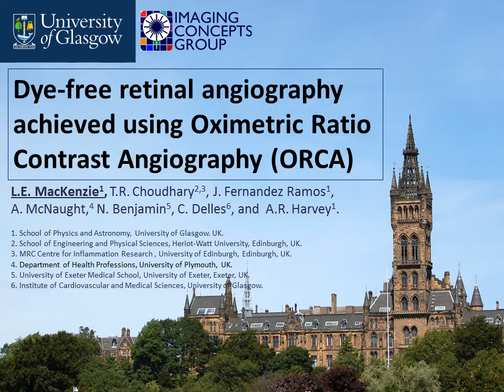So, hello again everyone. Now to talk about something quite different from other oximetry applications. I'm going to be talking about a new concept we've been working on here in Glasgow, which is achieving dye-free retinal angiography using multispectral imaging and a perturbation in blood oxygen saturation. And we've given this technique a slightly over the top acronym of ORCA.